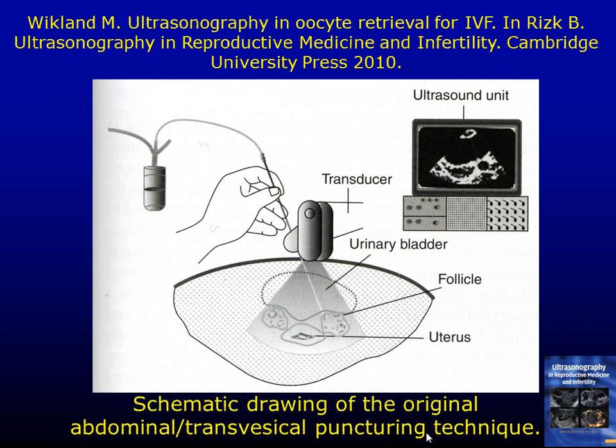Abdominal transducer. Our new generation probably have not, but you see it in the amniocentesis, I'm sure. But we did that in the 80s. I mean, it was technically extremely, shall I say, delicate. I mean, you have a transducer with one hand, typically your left hand, and with your right hand you go through the needle, you numb the anterior abdominal wall, you go through the anterior abdominal wall, anterior bladder wall, posterior bladder wall, then the ovary. And you ask the patient to keep still, and you're getting an egg by an egg. I mean, we did that for 2 years.